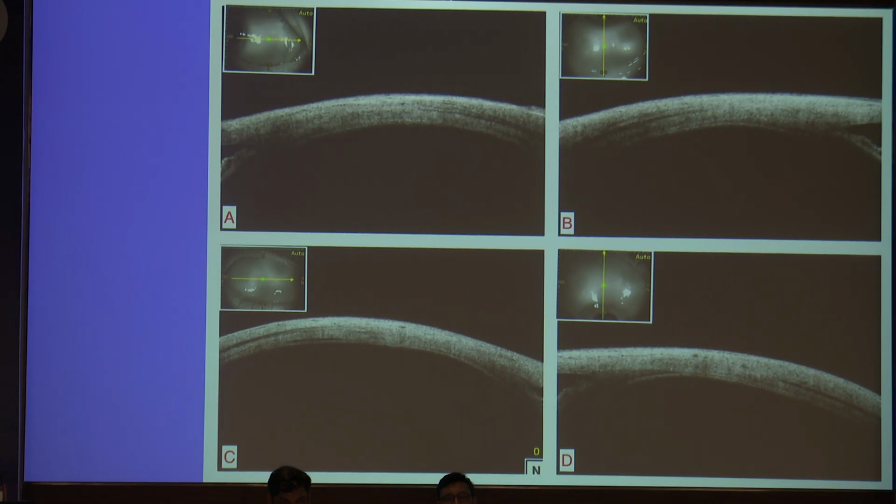So I will begin with the normal muscle, how to identify it. I want to tell you some of the features which have not been described earlier. So this is an extremely adducted eye, that is your elevated eye. This is an adducted eye, sorry, that is an abducted eye, and that is a depressed eye. So that is for medial rectus imaging. You want to take the patient to extreme abduction. So there you can see this is a muscle, right?